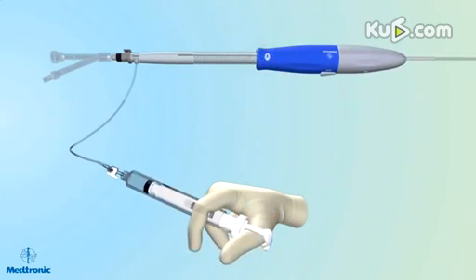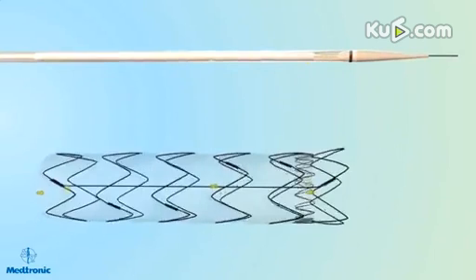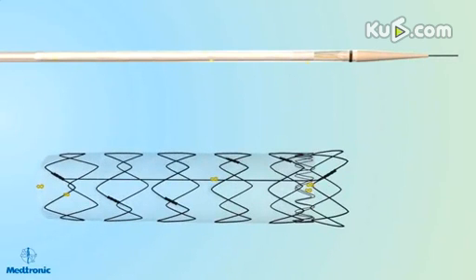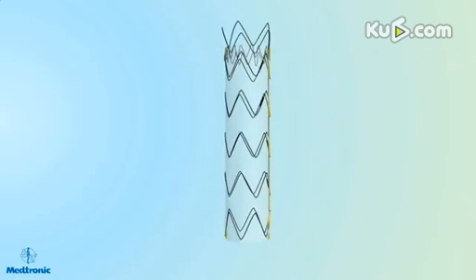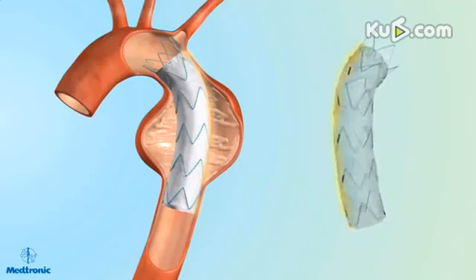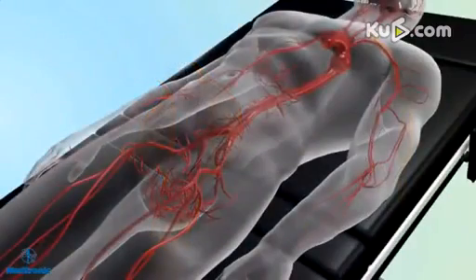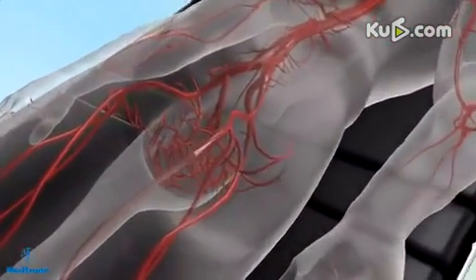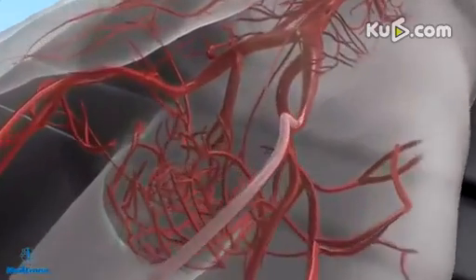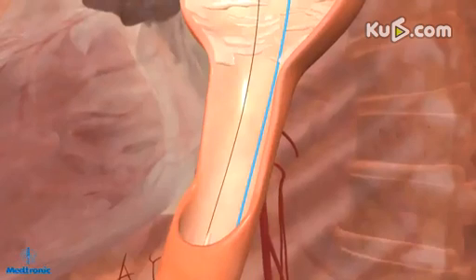After preparing the Accelerant Delivery System using the procedure found in the instructions for use, it is important to first locate the radio-opaque markers on the Talent Thoracic StentGraft to identify the location of the connecting bar within the sheath. Turn the sheath to align the connecting bar with the outer bend of the target vessel for implantation. An unaligned connecting bar may increase the likelihood of endoleaks post-implantation. Advance the delivery system through an incision in the femoral artery over the guide wire to the target landing zone, and be sure to monitor the proper orientation of the connecting bar while advancing the stent graft.